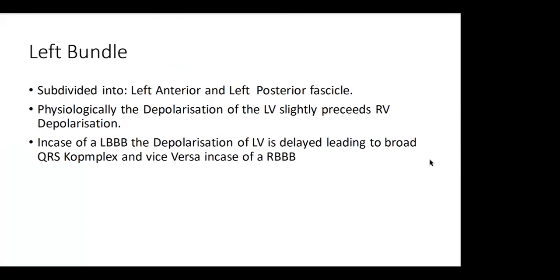So in case we have a left bundle branch block, rather LBBB, these things are very tedious for the mouth. But if you have an LBBB, if we have a block on the left branch, then it basically means the depolarization on the left side is delayed.